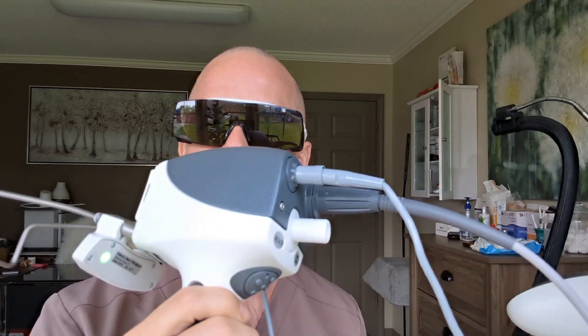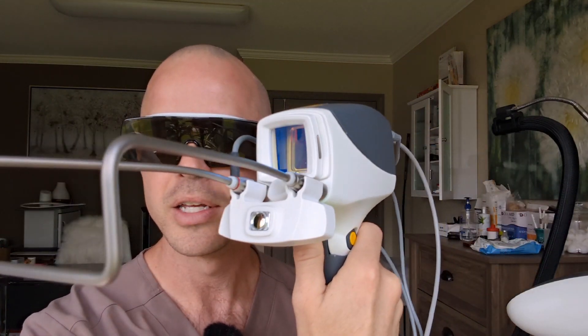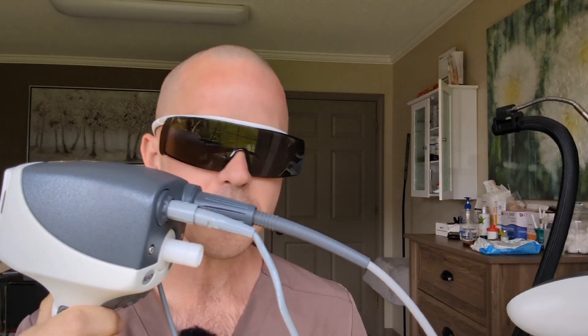I want to give a shout out to my peeps at Fotona — they produce some awesome technology. This is a great handpiece, they call it the L Runner, and it also turns into the S11. It's got cool sighting lasers on it that show me the grid of where I'm treating. It's pretty bright in here so you may not be able to see it all that well, but you'll see it when it's firing.